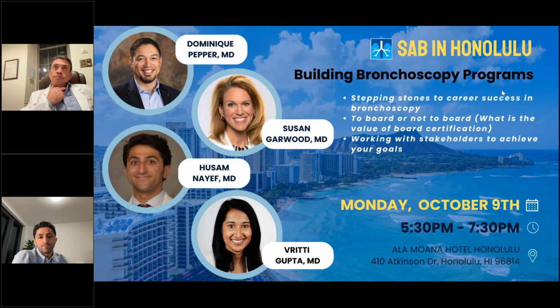Well, I would say that the procedure accomplished, like in that CAT scan video that I showed, yes, the left upper lobe is closed. So the valves did what they were supposed to do. Unfortunately, that patient's lower lobe could not fill the space. Yeah, I was referring to the terminal outcome where the healthy lung expands and improves the symptoms and everything.